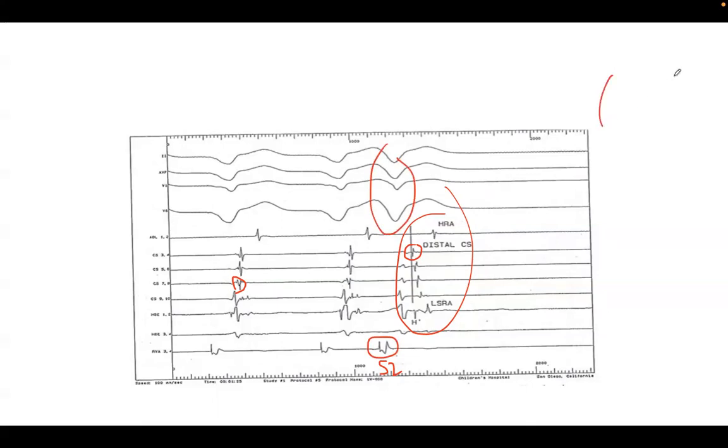Maybe one of them captured and reached the accessory pathway or something. Yeah, you are V pacing here, okay? We know this is a left pathway somewhere here, okay? And then, like we said, if you're RV pacing, you will go up the AV node and up the accessory pathway, right? So your earliest atrial activation would be somewhere in between, okay?